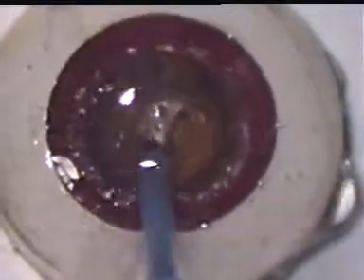After complete removal of the lens matter, the eye can be used for practicing insertion of rigid or foldable intraocular lenses.